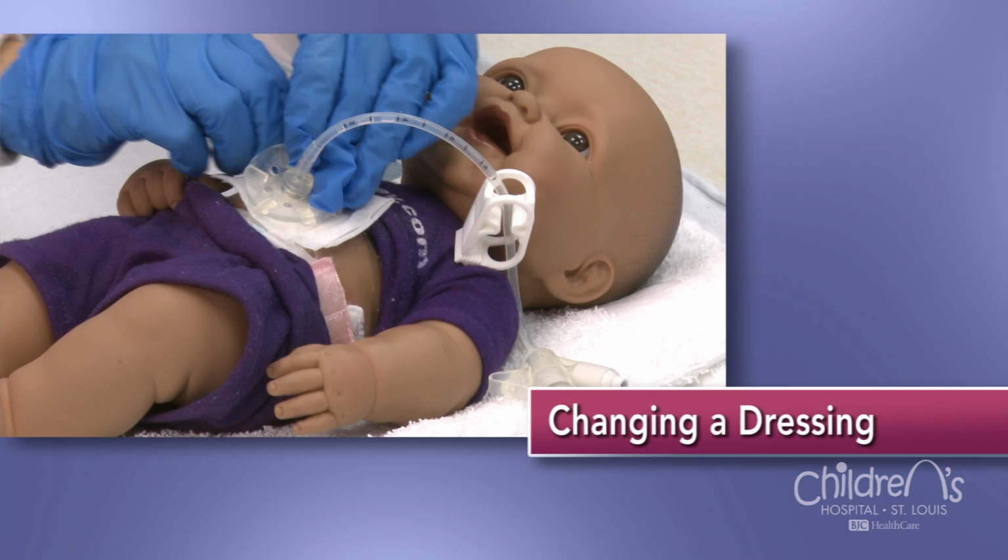Gastrostomy appliance sites rarely get infected, but leaking can commonly occur. A dressing may not be needed unless the site is leaking or you are instructed by a surgeon to place a dressing at the site. Bath time is a good time to change the dressing. If it has been less than 2 months since the button was placed, call the general surgery office with any questions. It's important to learn how to change the dressing around your child's gastrostomy tube.